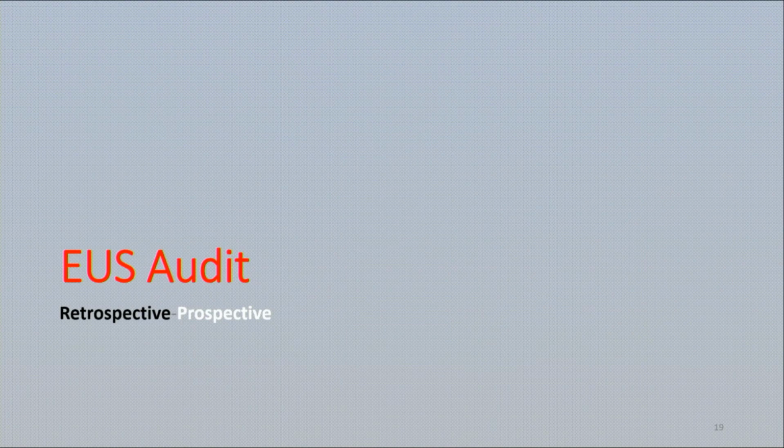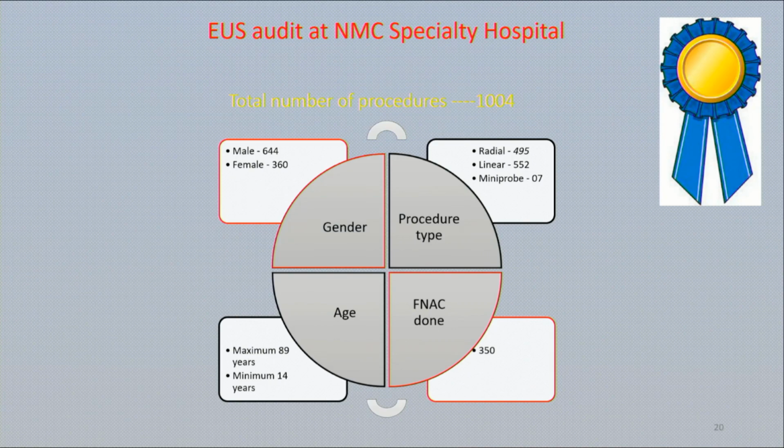Now I'll take you to my audit, which is partly retrospective and partly prospective. We did 1,004 procedures till last week. There is a skew in the gender numbers between male and female. As you see, the number of males is higher. That is because of the population here, as there are mostly male expats. It doesn't mean that the diseases are more common in males. The number of linear and radial EUS was about 50-50%. We did FNAC in 350 patients, and the age range of the patients was from 14 to 89 years.